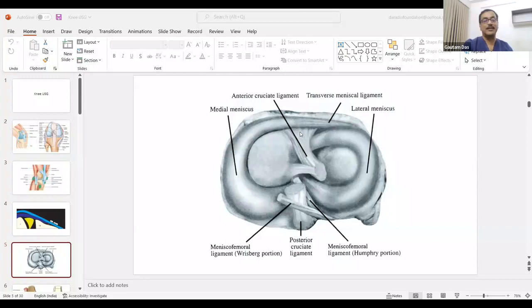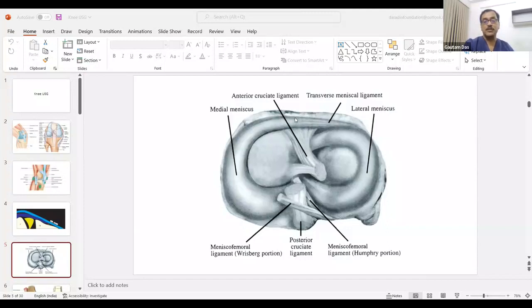When we scan the ACL, the anteracusciate ligament, a very important marker is the transverse meniscal ligament — also called the transverse ligament or intermeniscal transverse ligament. It bridges the anterior horn of the medial and lateral meniscus. The ACL starts inferior and posterior to that, getting attached to the inner part of the lateral condyle of the femur. The easiest way to see the ACL is to first find the intermeniscal transverse ligament.